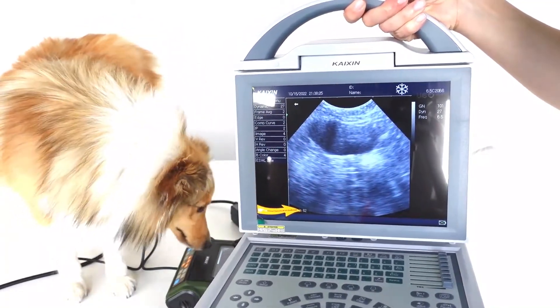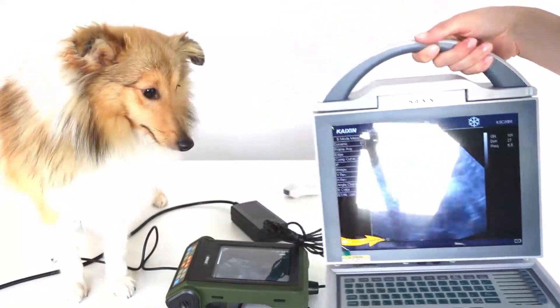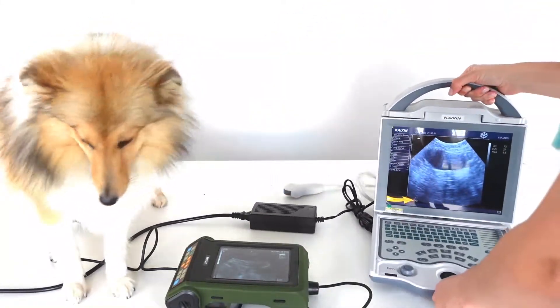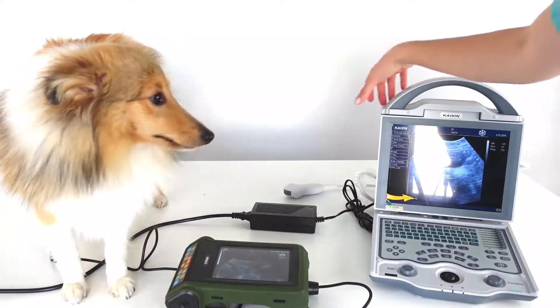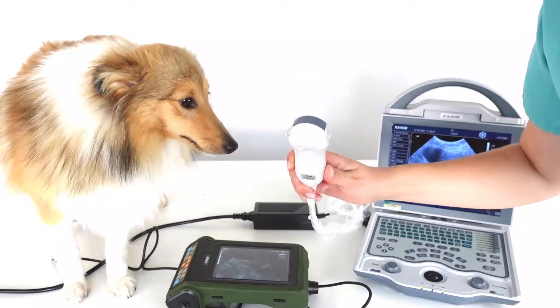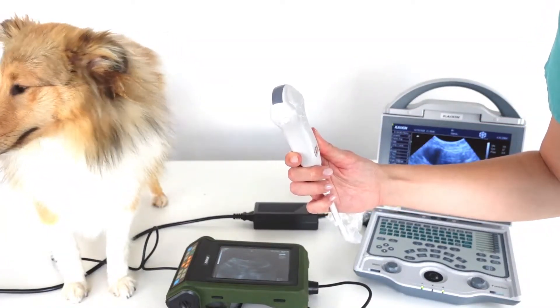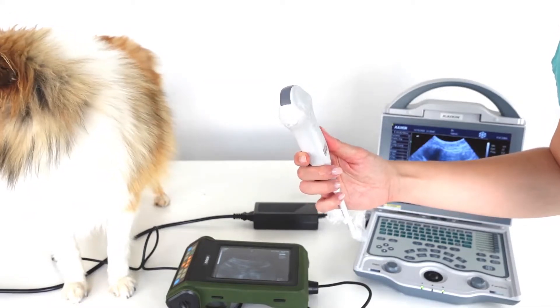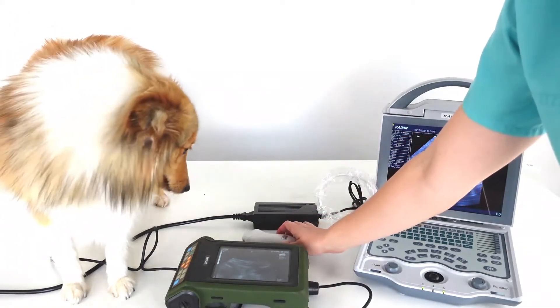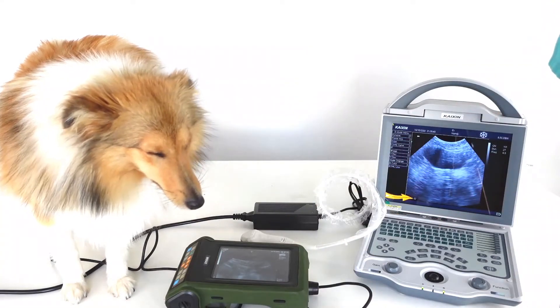On the electronic scanner the image is a lot clearer and the resolution is a lot higher. There are two types of probe you can get with an electronic machine like this: micro-convex, which is the best for dogs and also works for small farm animals like goats, and a larger convex probe which is better for very large dogs, sheep and larger goats.